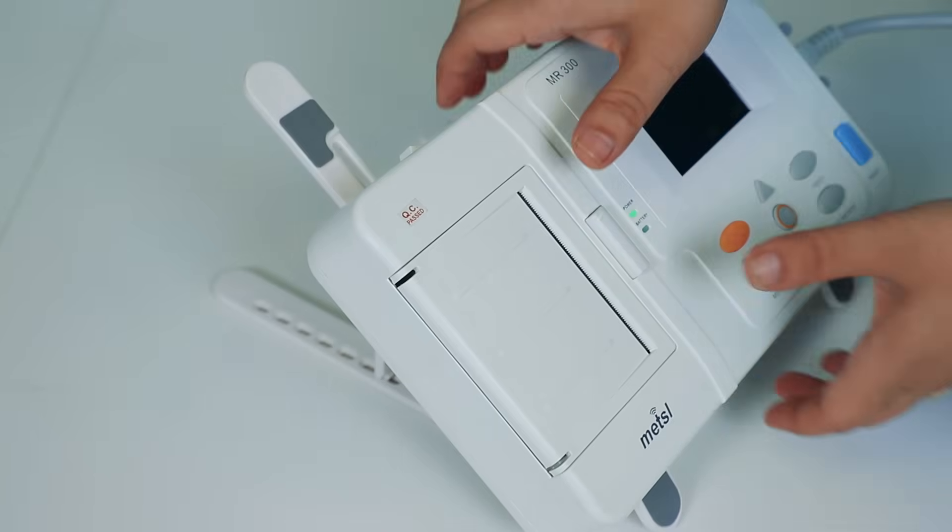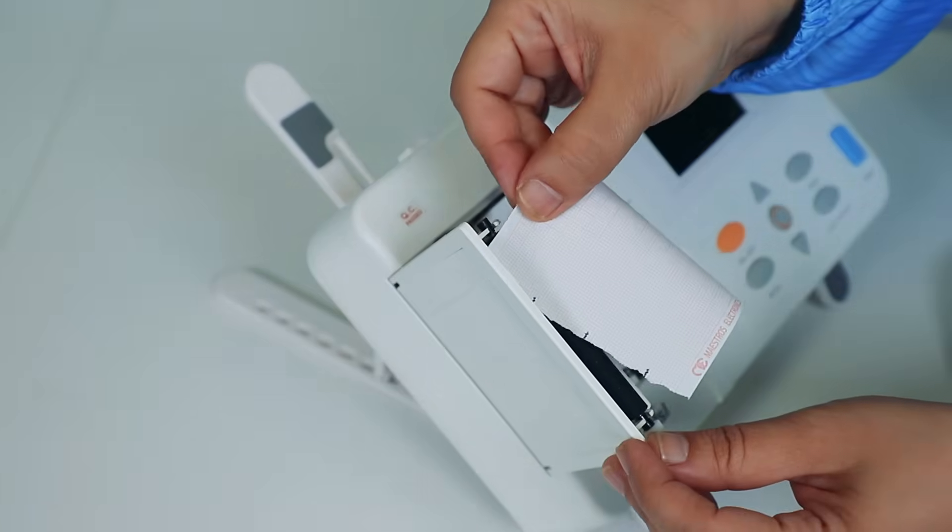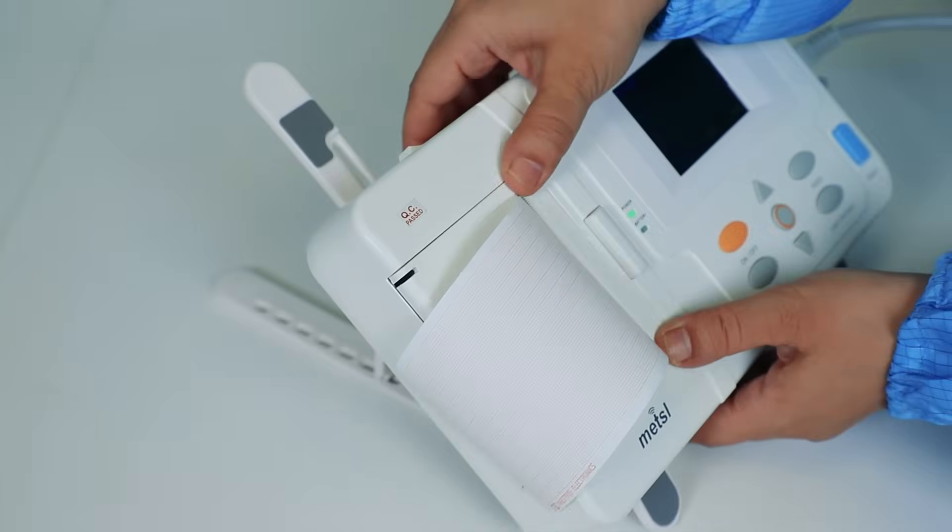Inserting the thermal paper roll is a simple, quick process. Just open the compartment, drop in the new roll, and close the lid. You're now ready for continuous operation.